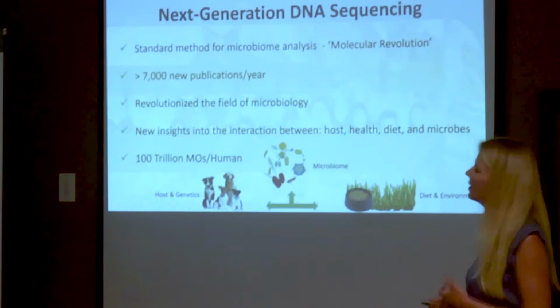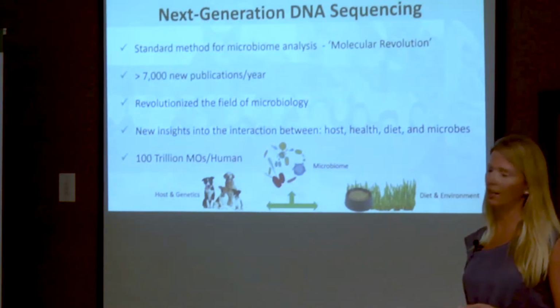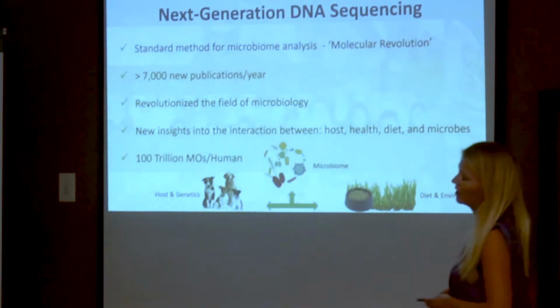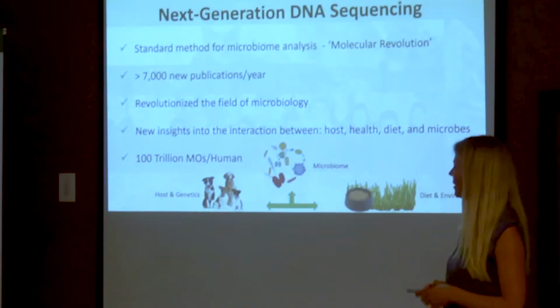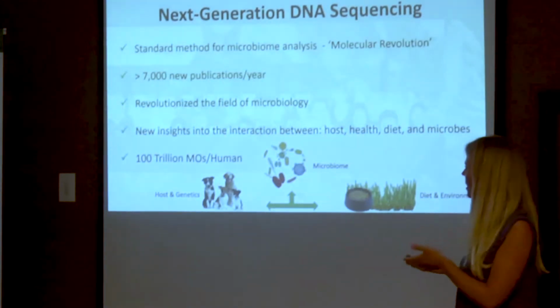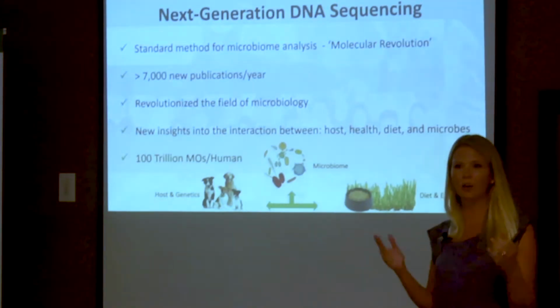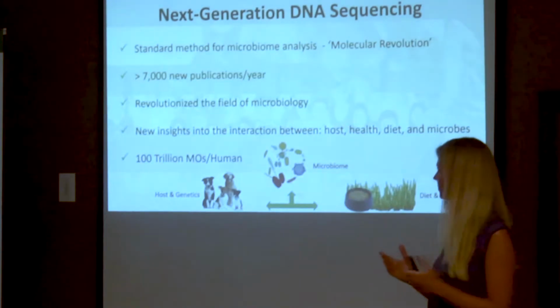And it's become really the standard method for any kind of microbial analysis that scientists might conduct, with more than 7,000 publications a year. It's hard to keep up with any of that research. And it allows us so much more insight into how we as hosts or our pets as hosts interact with the microbiome and the environment and diet. And all that is at an interplay and constantly influencing each other.